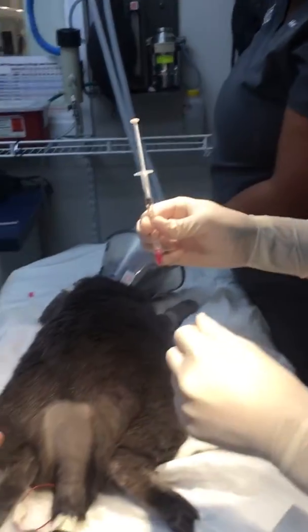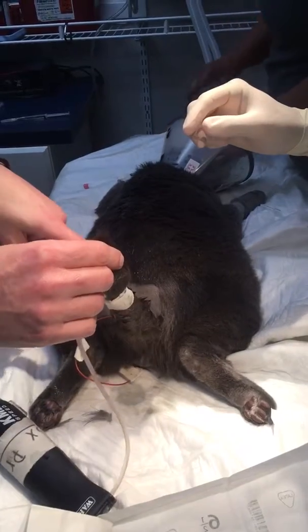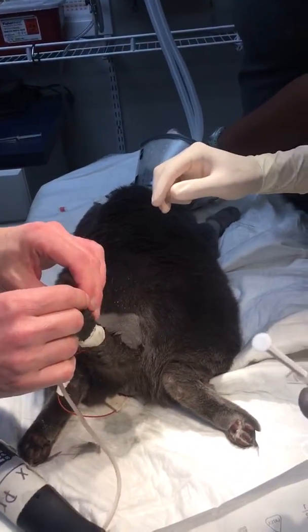So you want to hold this up, and then you want to feel, and you're going to put your needle in until it sinks.